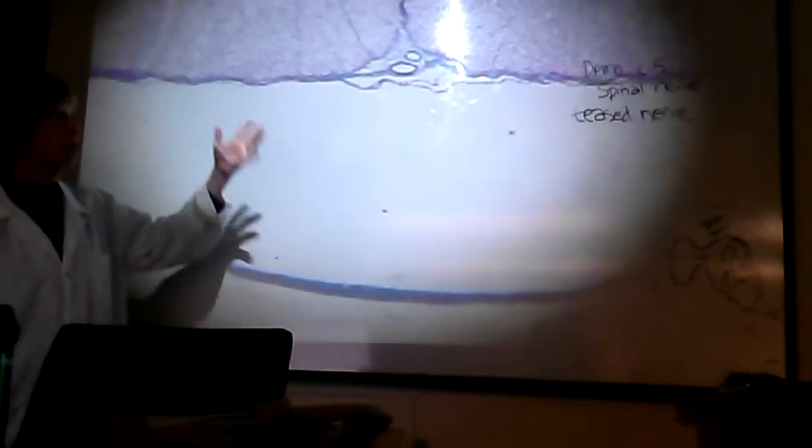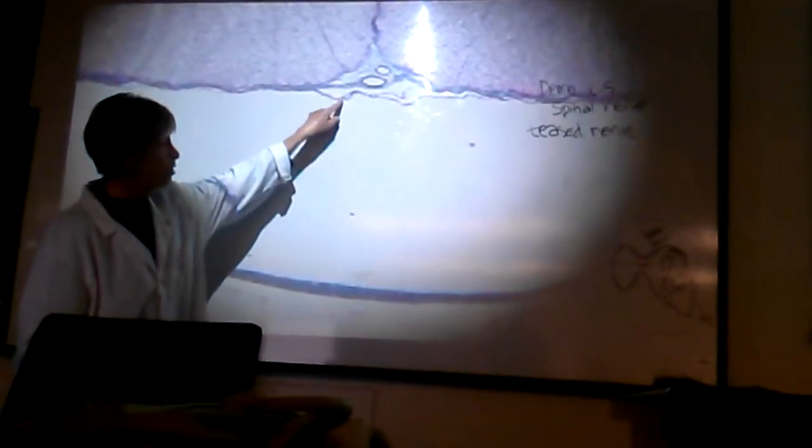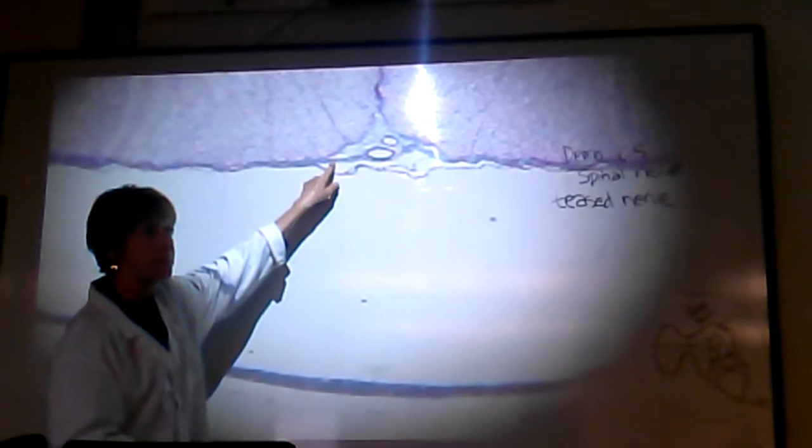And so this should be arachnoid, and I'll know it's arachnoid if I move out and find the dura mater. There. Here's the dura mater. This only shows up on this slide. I don't think it shows up well on the other one. Dura mater, tough mother, big, thick layer. There would not be a space between the dura mater and the arachnoid, but in the preparation of the slide, you get a big space. Then you have the subarachnoid space that's filled with cerebrospinal fluid, and then the pia mater. So on this slide, we see the meninges.